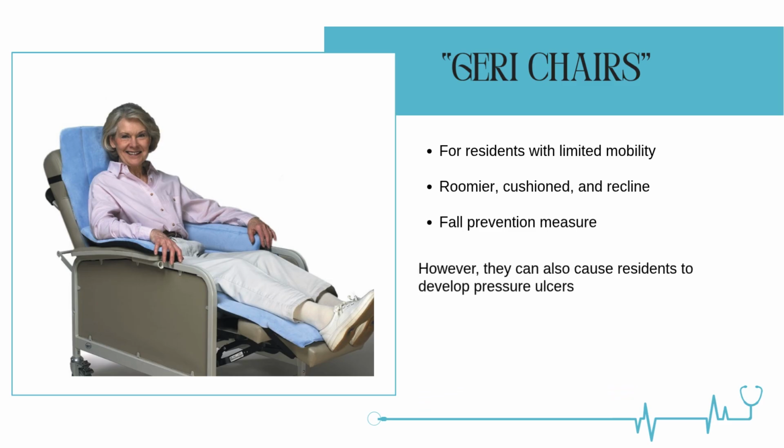However, there are risks associated with the use of geri chairs. One of the main risks is that if left sitting in one position for too long, residents in geri chairs can develop pressure ulcers.